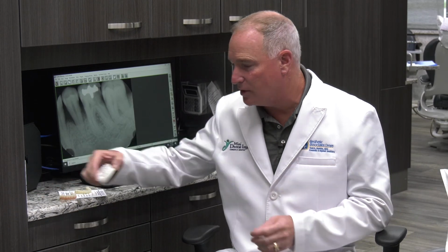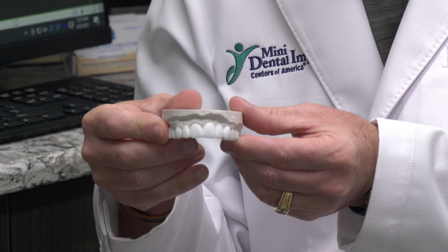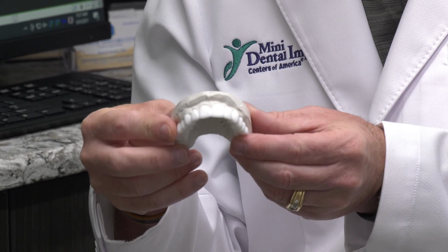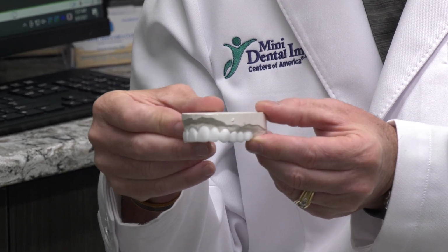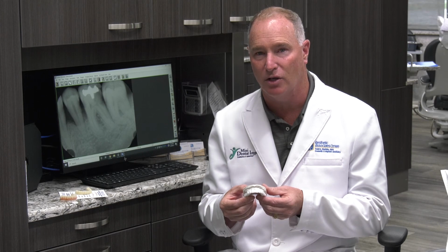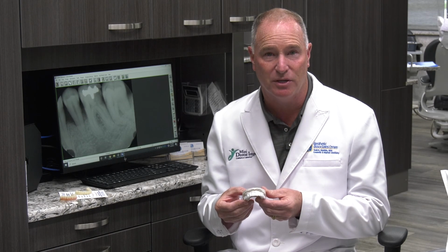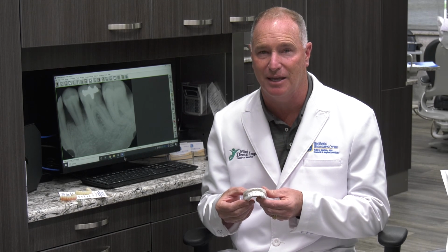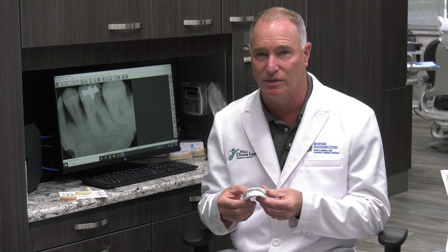The next thing we can do is a diagnostic wax up, which is simply sending in those models and having our lab do a wax up on the teeth or on the ridge so that you can present it to your patient, if you so choose, to let them see what the teeth might look like after they're all done. This is an optional step, but in certain situations I like to do this, especially if I have a very particular patient and I think it's going to be a tough case to get a perfect result with.